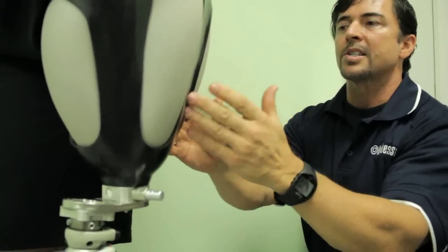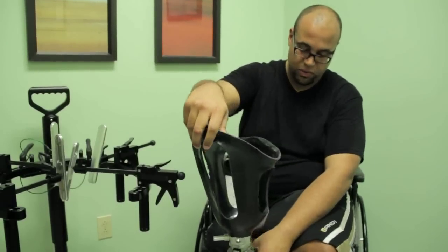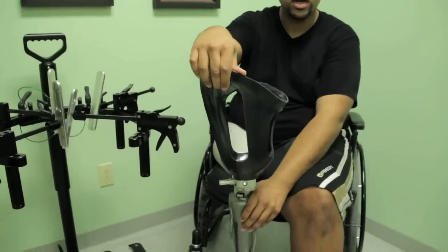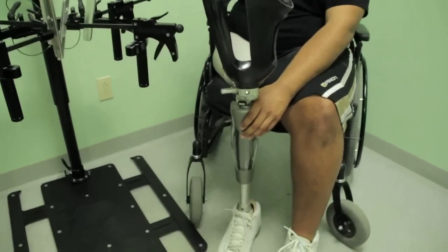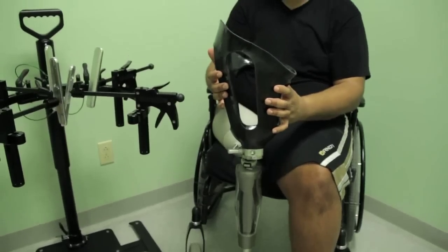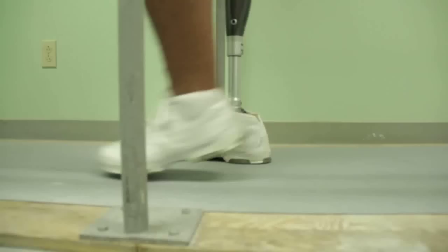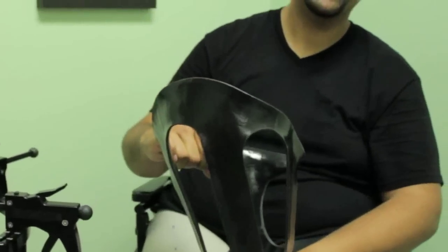It also allows him to use less energy when he walks. I'm really pleased with everything. The fit was great. I felt really stable when walking. I didn't really have to look so much at my foot. Because it's tight up here, it doesn't wiggle around when I'm walking, so I'm much more confident about foot placement. I'm excited. Now I'm just ready to get it home and give it a whirl — get used to it, see how much weight I can lose, and get back down in fighting shape.